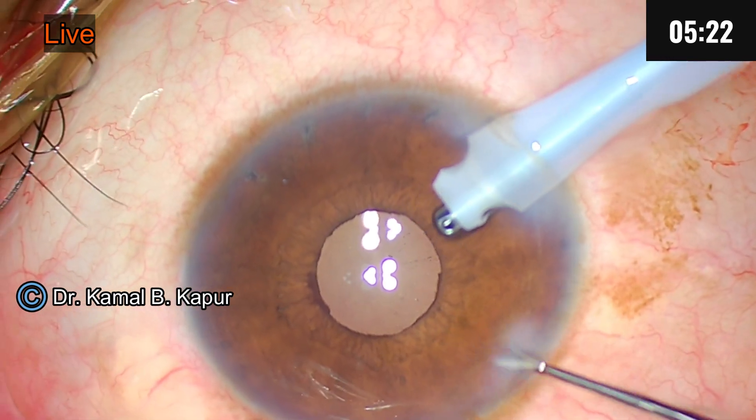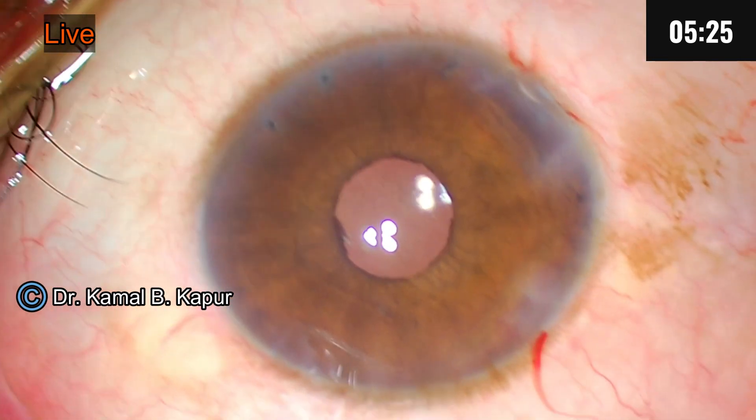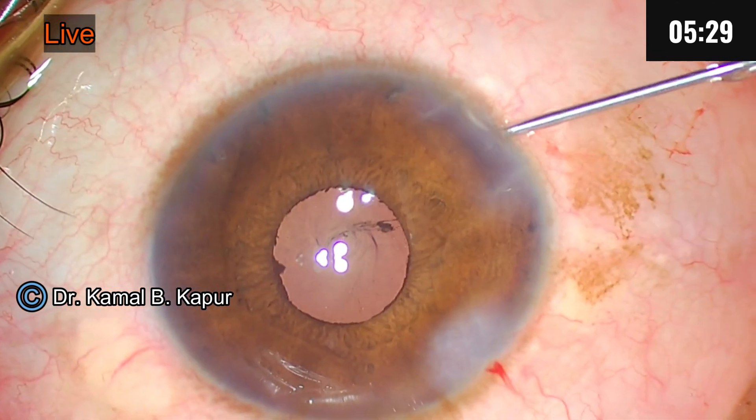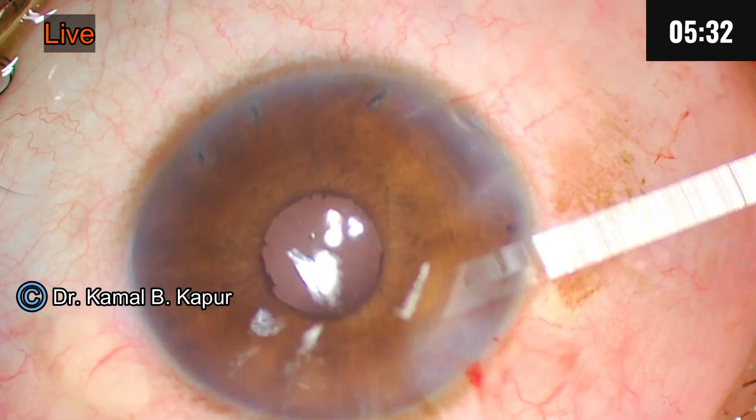So we performed a peripheral iridotomy, put the patient on NSAIDs, waited for some time, and then proceeded. The surgery went very well. Thank you.